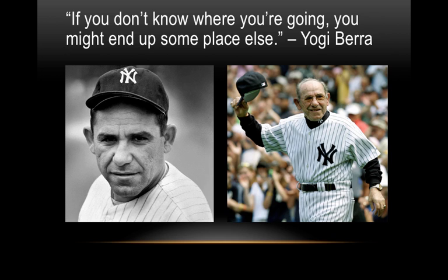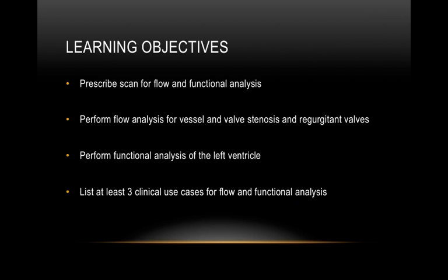I want to start with our learning objectives because, as Yogi Berra once said, if you don't know where you're going, you might end up someplace else. So I think it's a good idea for us to keep our learning objectives in mind when we're going through the presentation. So here are our learning objectives.